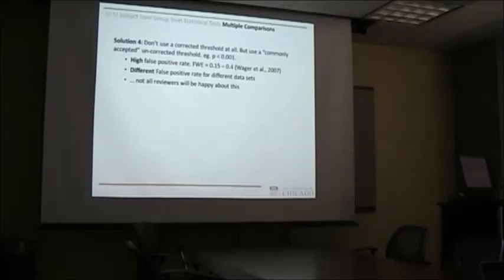it's somewhat fine in a way if you're exploring a little bit in what's going on in your data, but it definitely has disadvantages. And I think it's just a really practical thing. If you're writing a paper, you know, it's more and more likely that reviewers will not buy it if you don't apply actual correction methods. So it's still really common, but it's tricky to not do any correction.